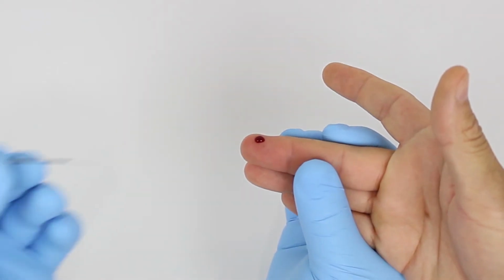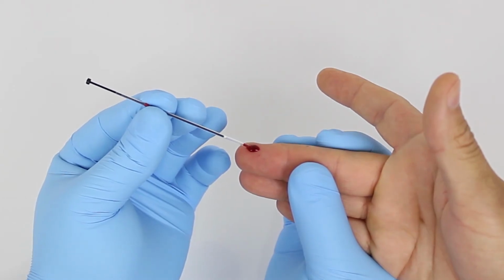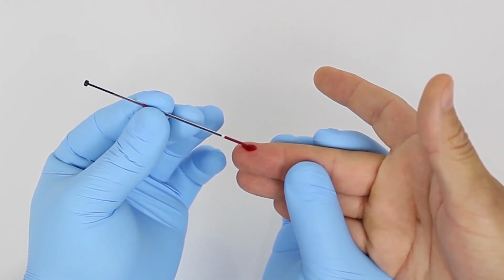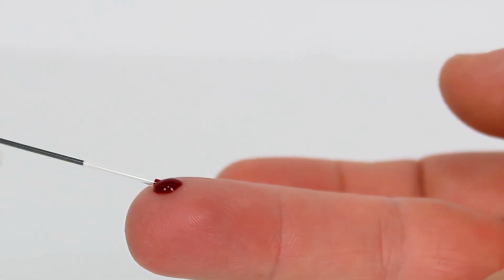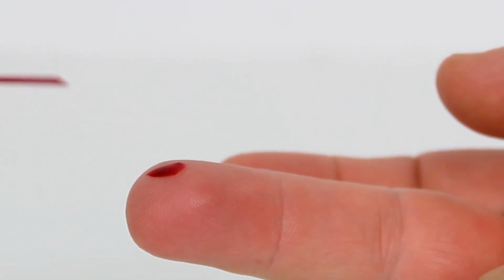Please remember, squeezing or milking the finger stick site excessively releases interstitial tissue layer fluid containing tissue factors that can cause unreliable results. Collect the sample using a sample transfer tube. Holding the transfer tube horizontal, touch the tip to the bead of blood and let capillary action fill until the blood flow stops at the white plug.